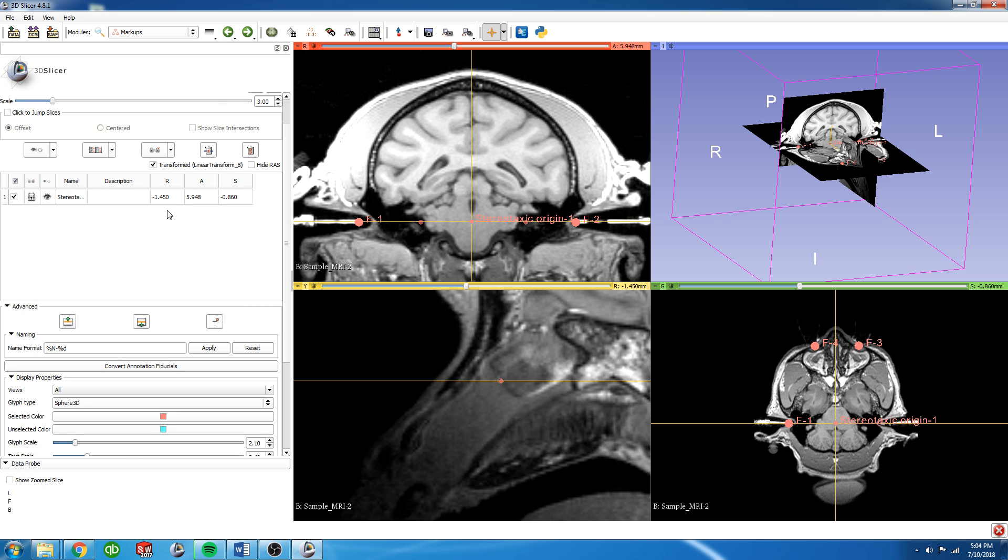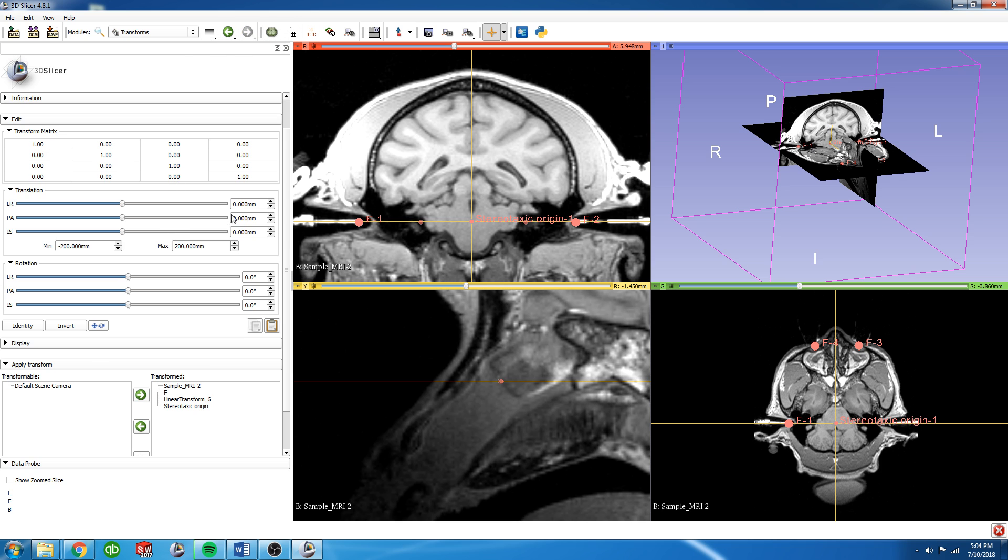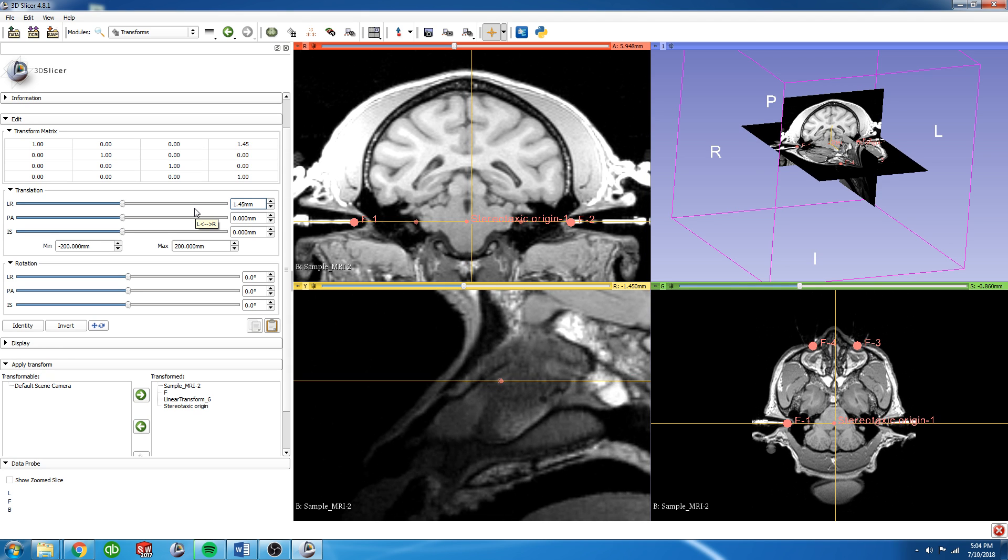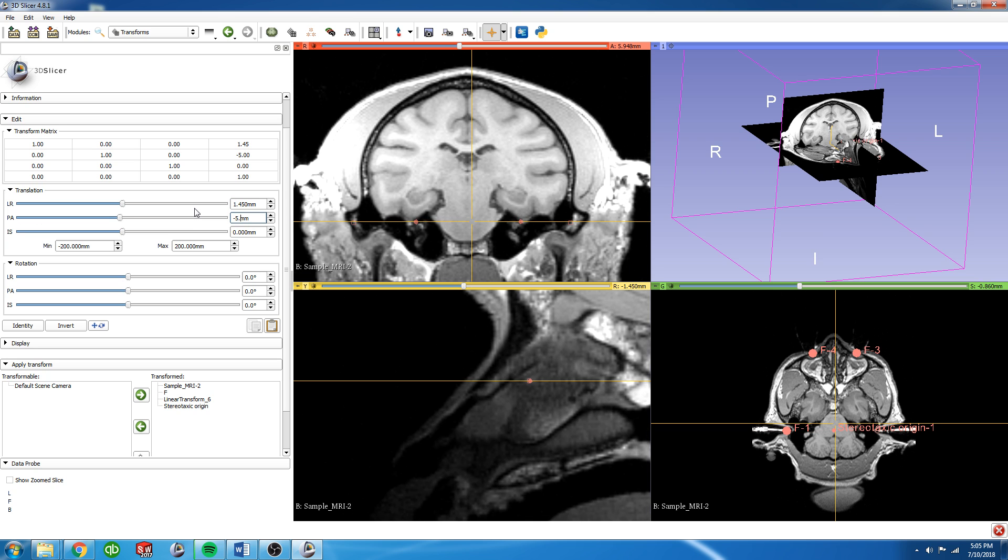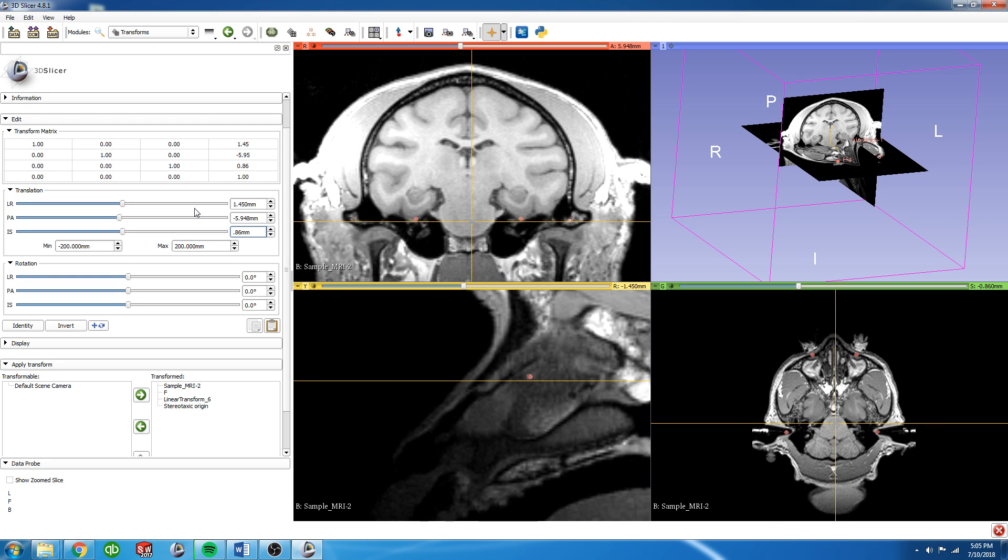So if we go back to there, we can see that it's these values. And so we're going to have to do a positive, a negative, and a positive of these values to get this to translate to 0, 0, 0. So if we go back to the Transforms box, we can just input those numbers. That was 1.45, minus 5.948, and then positive 0.86.